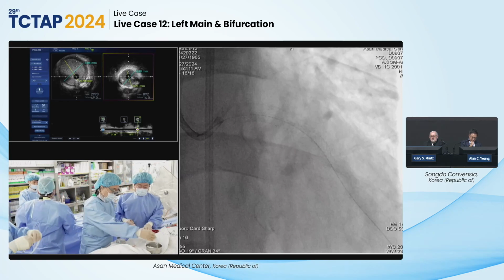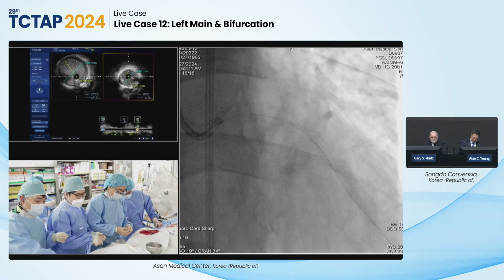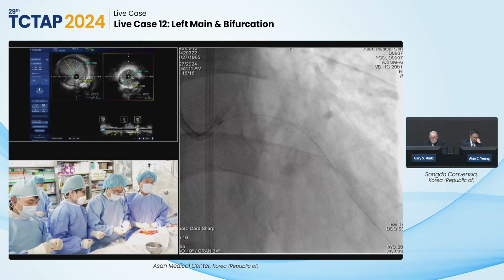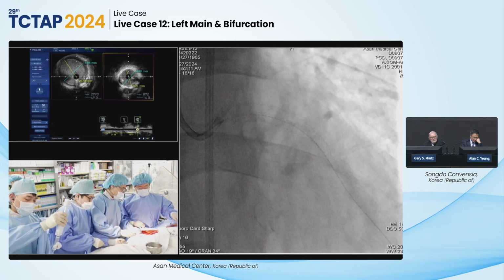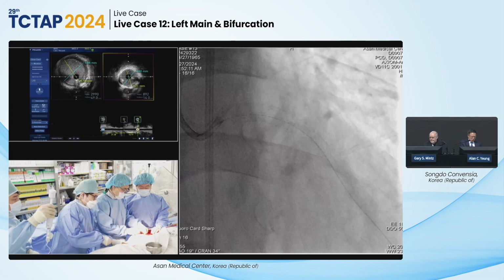3.5? Yeah, 3.5. And how about the opinion on this: superficial calcium was seen in the IVUS, and for lesion preparation, you're going to use just the NC balloon.